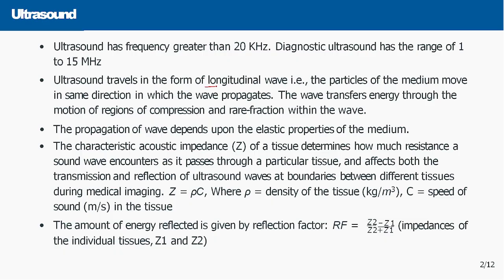Longitudinal waves means the particles of the medium move in the same direction, that is, parallel to the wave propagation direction. So if the direction of propagation is in this direction, the wave is also moving in this direction like this.